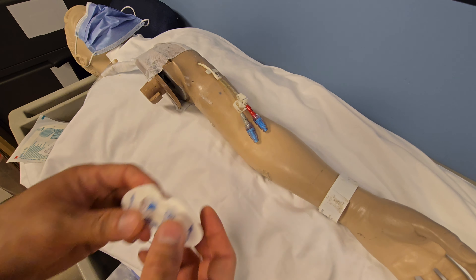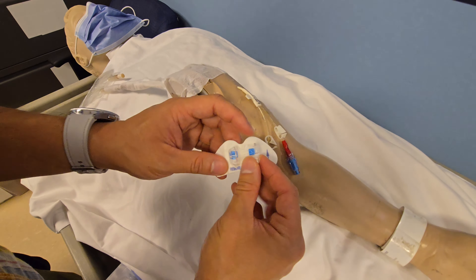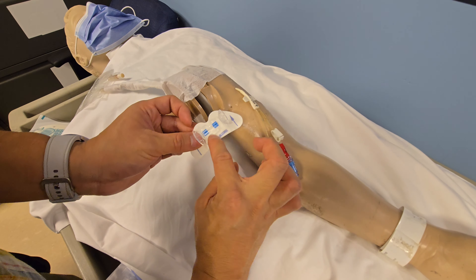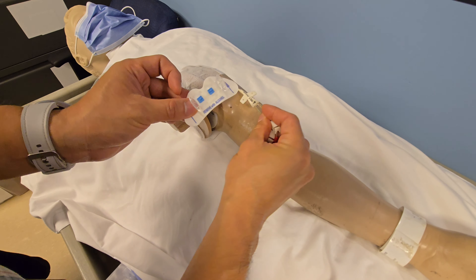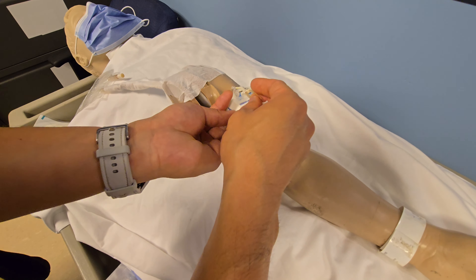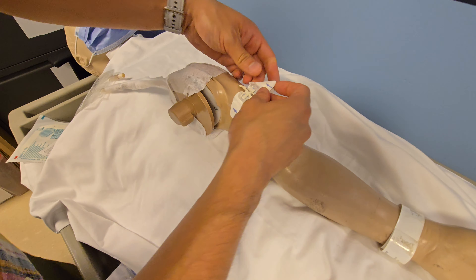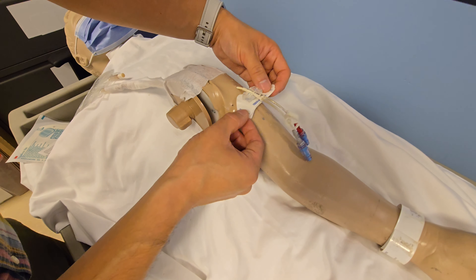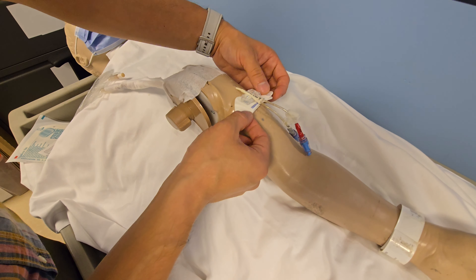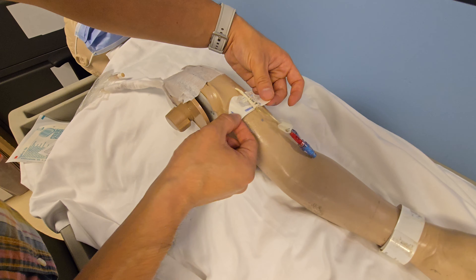When it comes to the stat lock, you're going to see that this one has these two little ports — almost like two spikes. The two openings just kind of spike in. I always recommend that you put the stat lock on first, and once it clicks on this side, then you can maneuver the line. Try to give the skin a little bit of a break — don't put it on the same spot; try to move it just adjacently.